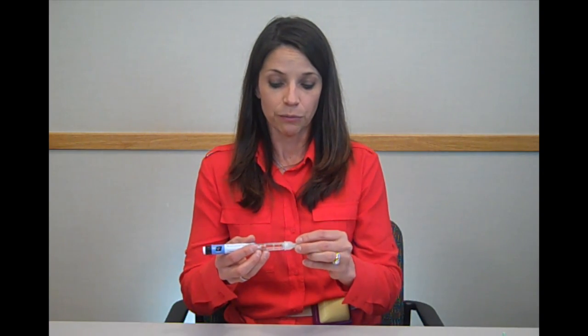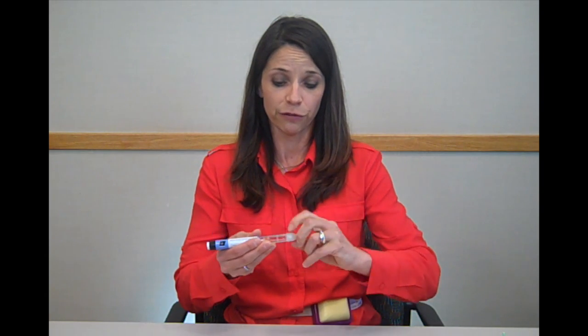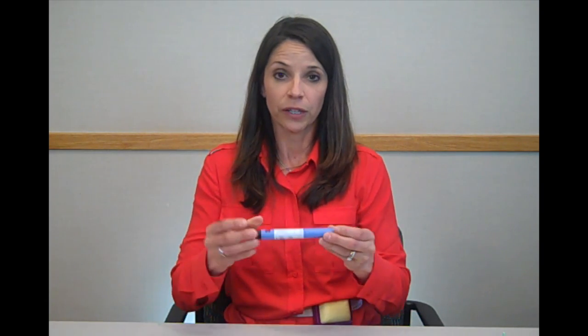You can remove the pen. Take the outer cap that you set aside, place it back on the needle and screw it off. Place this in a puncture resistant container. Replace the cap onto your pen and you can set aside at room temperature for your future dose. If you have any questions, please contact your provider or pharmacist.